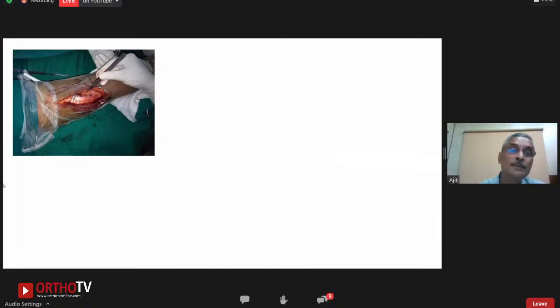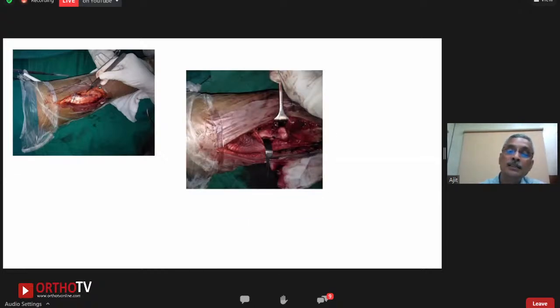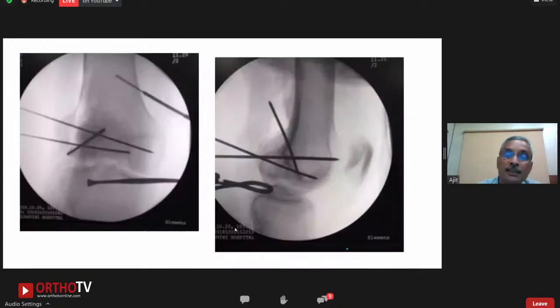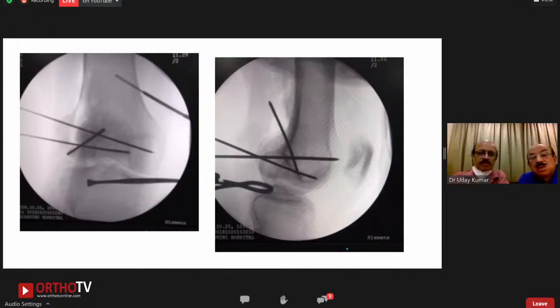So isolated that, and then went medial. That's the nerve here now, and we went medial to the head of the gastrocnemius, got the reduction. And unlike what Prof said, I did not actually understand the impaction part of it. Although we do see that in the acetabular fractures and also in the distal plateau, but I did not understand it. So we just placed it back in an anatomical position and got that back. We're still on the medial side. So some K wires to get the reduction, multiple K wires to get the reduction there. Fragments would have helped. Yeah, in place.